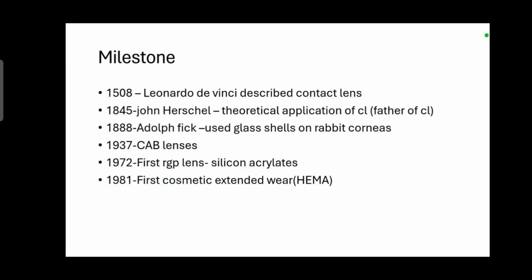In 1508, Leonardo da Vinci described the contact lens. The suggestion that ametropia could be corrected with a water-filled lens placed directly on the eye was made by Leonardo da Vinci.